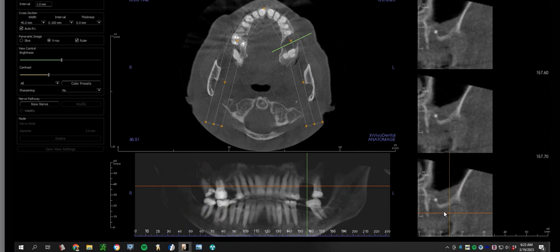Again, without question, a sinus lift is going to be needed. Honestly, I would like an 11, 12 millimeter implant here because of how tall the crown's going to be, which wouldn't be difficult. We calm the sinuses down, we remove the infection, and then do a sinus lift. But again, thinking with the end in mind.